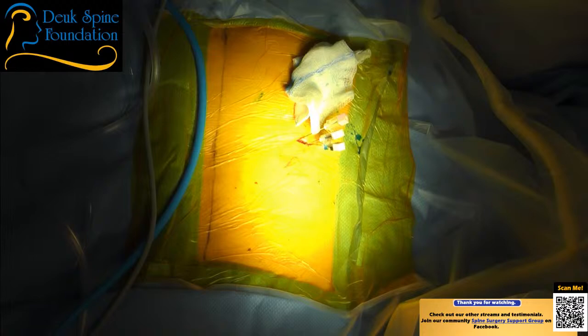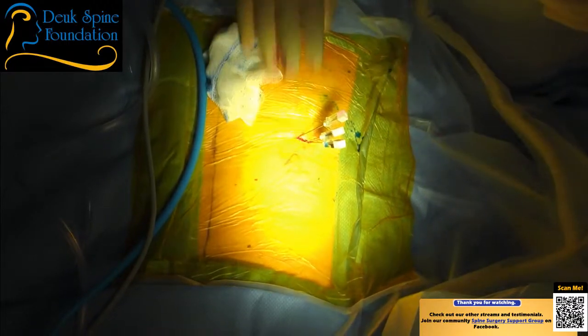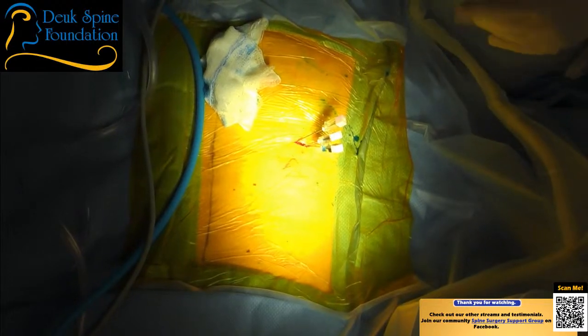I wonder, is that better? Are you more comfortable? Yes. You know, I'm going to try one more thing. Let me have another needle. And let me have some local. Can I have a needle, please? Local.